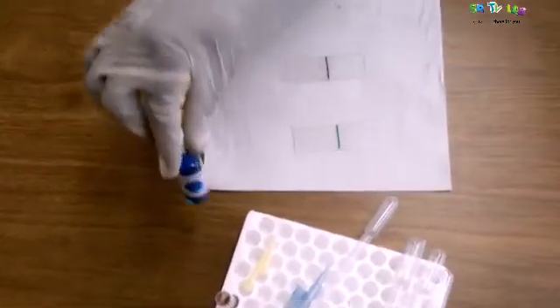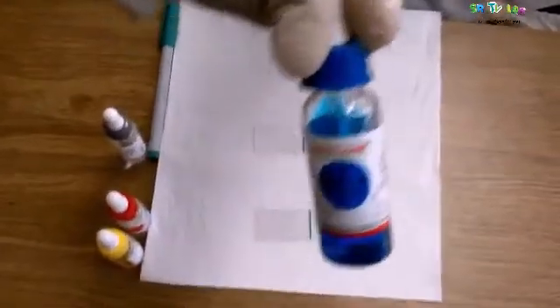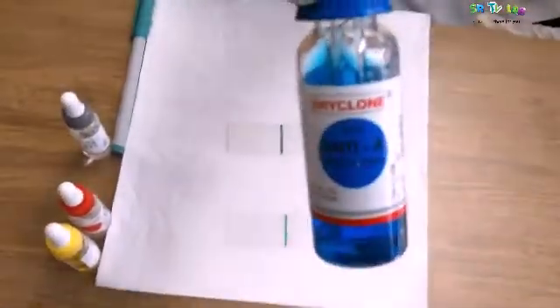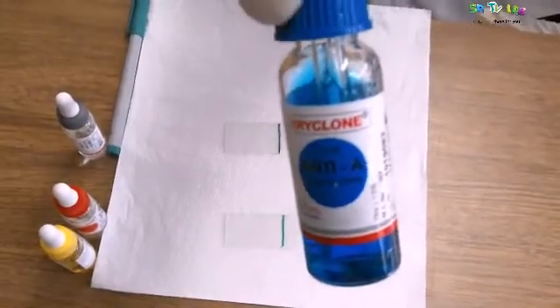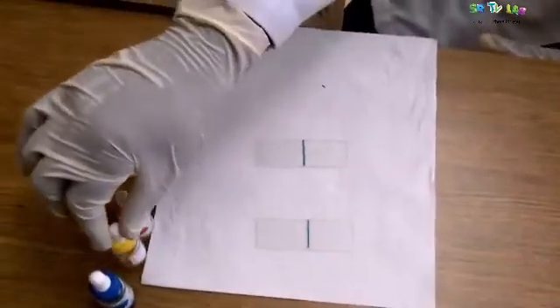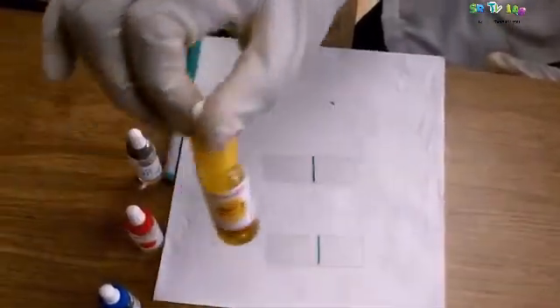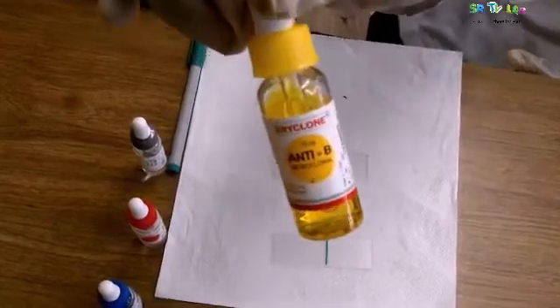In order to know the blood group, you need these reagents. This is antibody anti-A, which means it is against antigen A. This is the antibody anti-B.